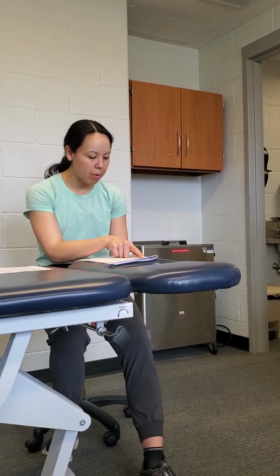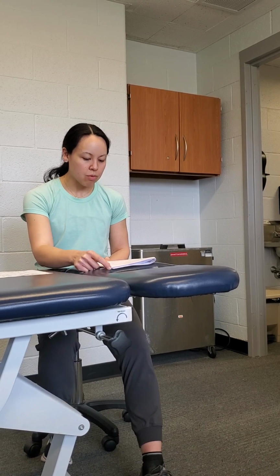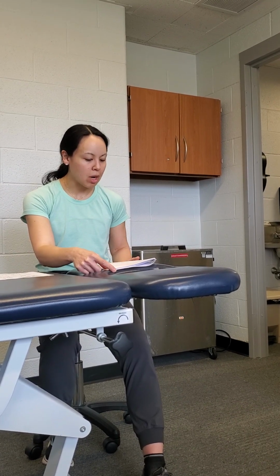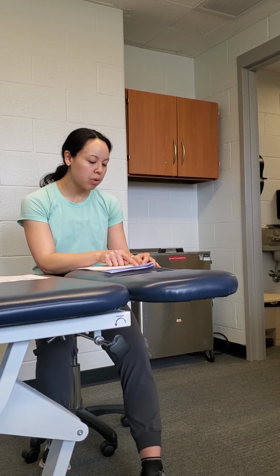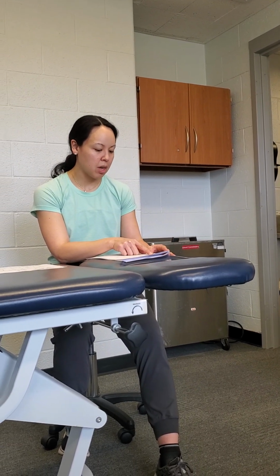Number two is aerobic. So this introduces some voluntary muscle contraction, and in rehab is typically used as a means of progression to resistance exercise, or a means of adding exercise volume. And then number three, which is probably what we're going to be using it the most for, is resistance, to build muscle strength and hypertrophy. It's the most powerful rehab tool. It gives us the ability to increase muscle size and strength when we otherwise could not.